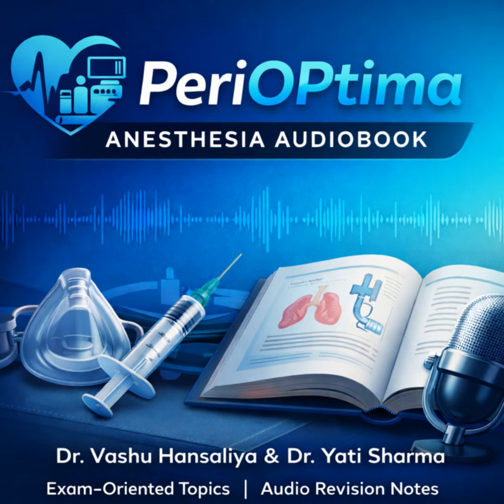What about the larger cylinders, or more commonly, the pipeline sources coming from the hospital wall? For the large cylinder valves, which are screwed directly into the machine, we use the non-interchangeable screw thread system. So different mechanism. A different mechanism, same principle. This indexing relies on gas-specific differences in the diameter, the thread pitch, and the connection size. So an N2O valve just won't fit an O2 port. It just won't. The threading geometry is different. It operates just like PISS, but with threads instead of pins.